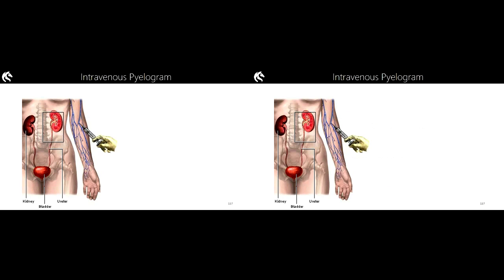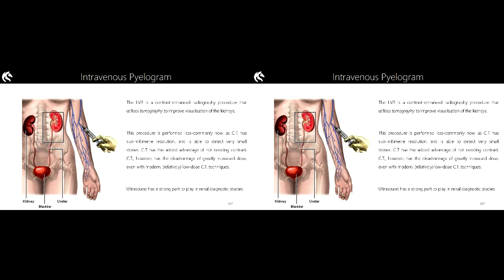I'm going to talk very quickly about the intravenous pyelogram examination. For those people who have already done the tutorial, this information will be just very quickly repeated. Here goes. We don't do them anymore. In previous years I would have called it a dying examination. I've made the call that 2019 is here, and so it's a dead examination. It's a dead examination because it requires contrast, and we want to try to minimise patients' use of contrast. It's a very technically challenging examination which requires a fair amount of radiographer skill, and that skill is currently not taught and not appreciated.